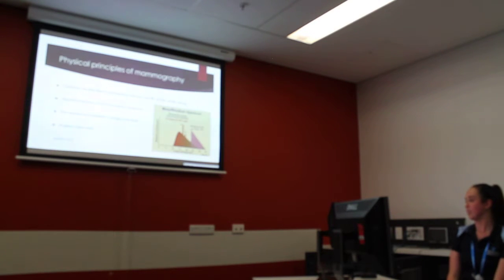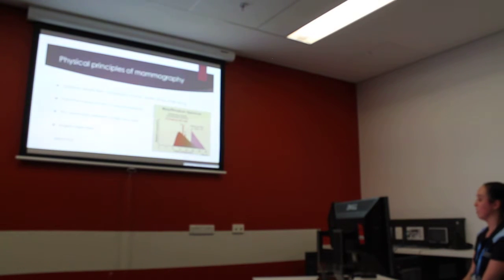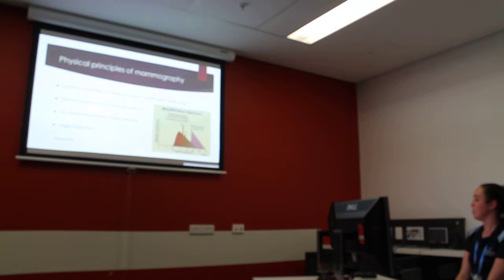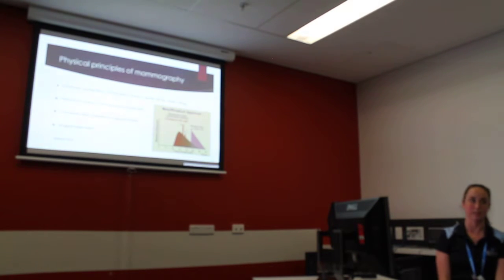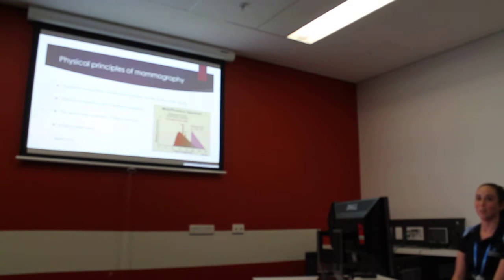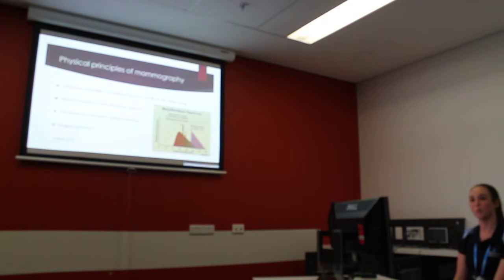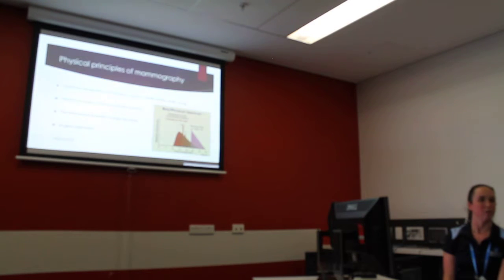A recent study featured in the Iranian Journal of Radiology suggested that tungsten and rhodium anode filter combination is the best choice for mammographic imaging when compression of the breast is between 4 to 6 centimetres. So if it was a little bit less, which is, if you're a very good mammographer, you can get a little bit less than 4 centimetres. However, if it's a little bit more, depending on the density, depending on the thickness, you may have to go for that slightly higher anode filter combination.